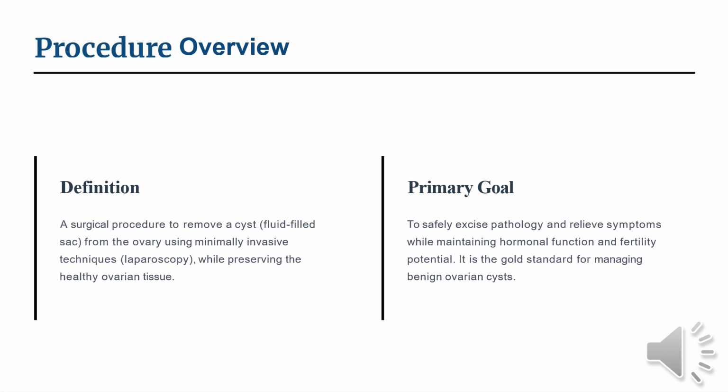Laparoscopic ovarian cystectomy involves the removal of fluid-filled cysts from the ovary. The primary goal is to excise the pathology while preserving ovarian tissue and fertility. This method is the gold standard for managing benign ovarian cysts, and it offers both safety and efficiency.